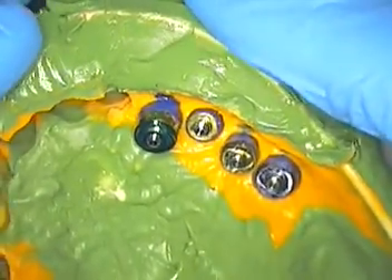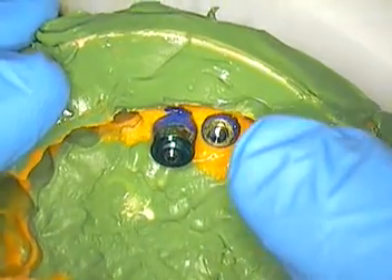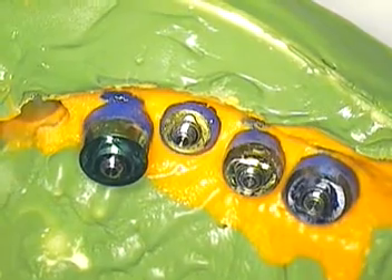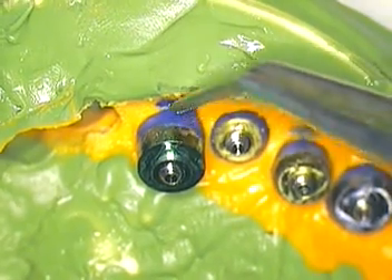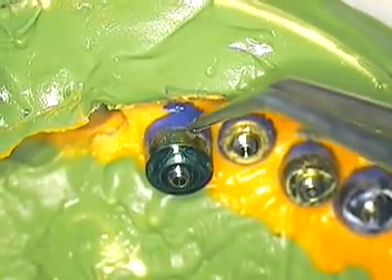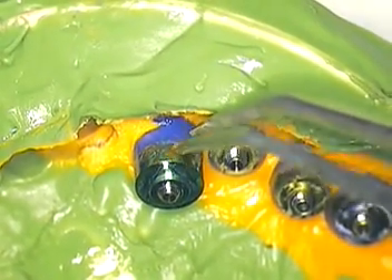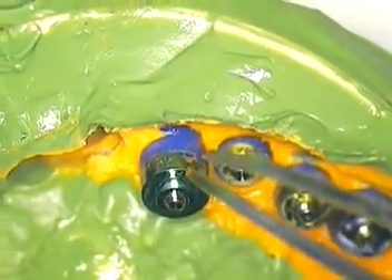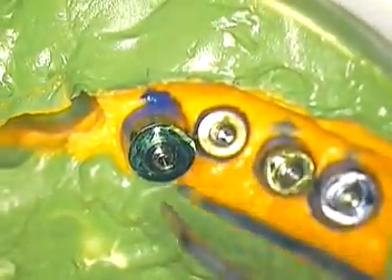Now in the impression there's a dramatic difference — you have the color code green and then yellow over here. I wanted to make a few points on this case. We had to definitely extend the collar of the impression coping greater than what's given — it only gives us about three to four millimeters in height, so we had to go all the way up to at least five. We did that successfully and took our impression, even having to modify one of Nobel's implants.